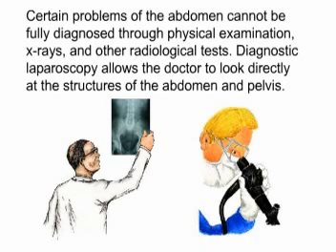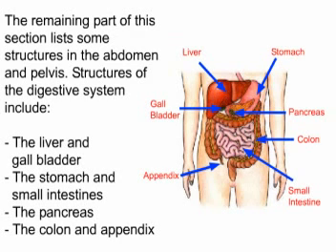Certain problems of the abdomen cannot be fully diagnosed through physical examination, X-rays, and other radiological tests. Diagnostic laparoscopy allows the doctor to look directly at the structures of the abdomen and pelvis. The remaining part of this section lists some structures in the abdomen and pelvis.